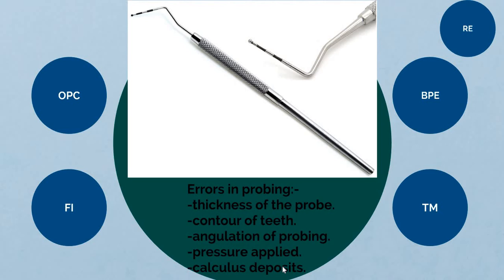About 20 to 30 seconds after probing, each site is re-evaluated to determine the presence or absence of bleeding from the base of the pocket. So you shouldn't hesitate, and be quick in examination. Why? Because the bleeding needs from 0 to 30 seconds to appear while you are probing. So you should probe all of the surfaces, then return and check the sites of active bleeding.